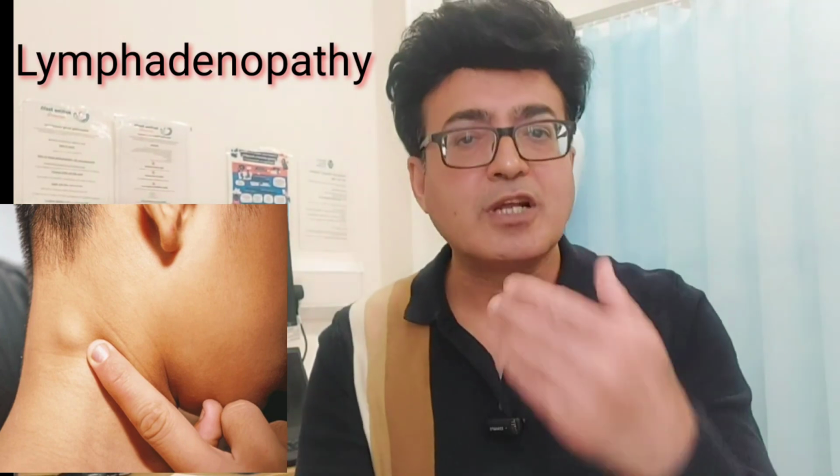You must mention this in your report, and then consider whether it is inflammatory in nature, or it could be tuberculous in nature, it could be secondary to metastasis, and as a fourth differential you may think of lymphoma if the patient history supports it, and you may think of carcinoma as well. You should consider all these points by taking the history and looking at the previous medical record. All this will help you shape your differentials and diagnosis.